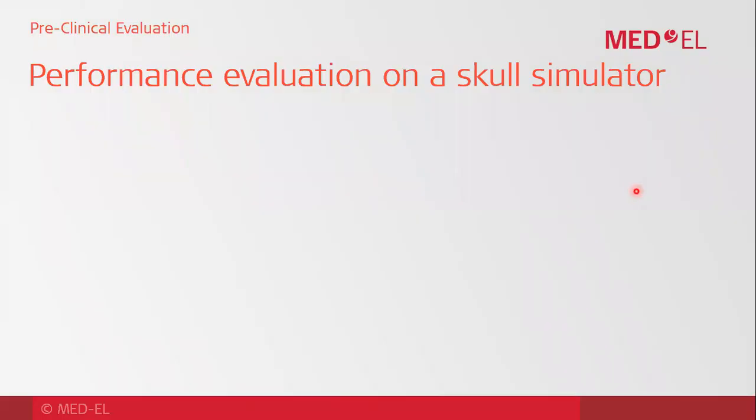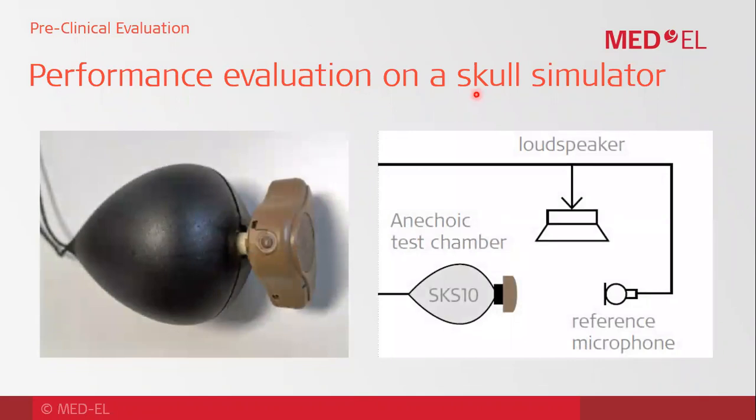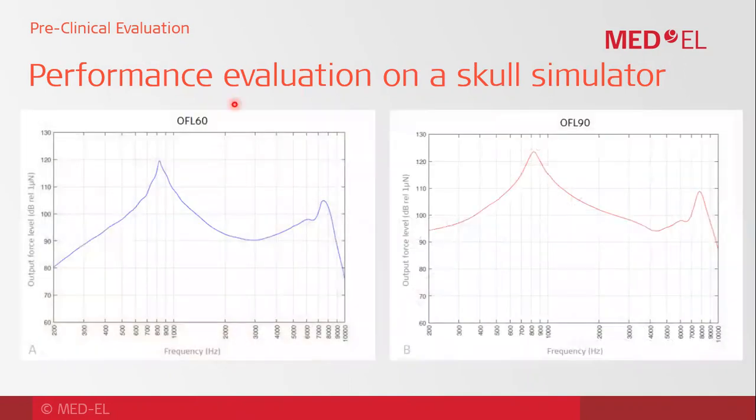So now let's have a quick look at the performance evaluation of the ADHEAR and some preclinical evaluation. In this evaluation, we had a skull simulator, SKS10, and we have the loudspeakers and reference microphones, and we wanted to evaluate the performance of the ADHEAR, and the results were really impressive. So here is the output force level for the ADHEAR at 60 dB.